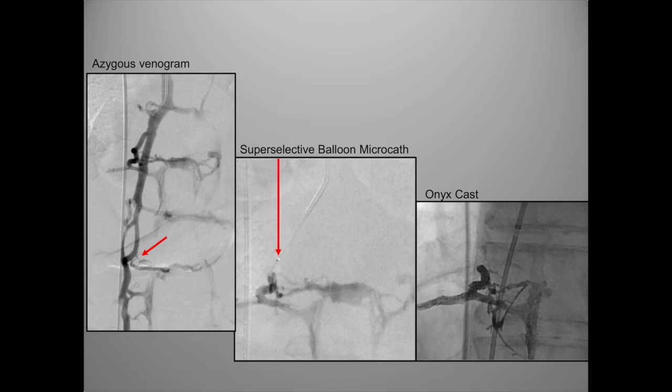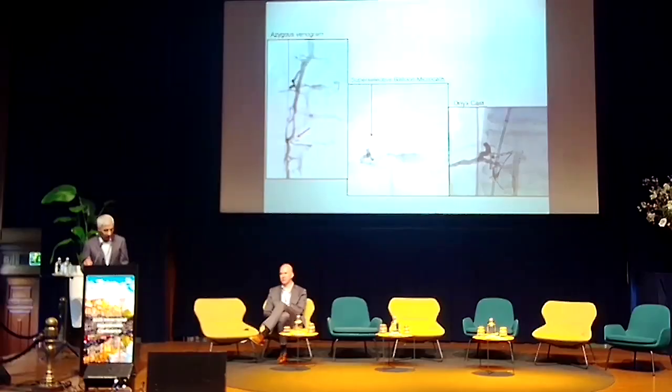And here you have an actual case where we drop the microcatheter and balloon to the level of the epidural neuroforaminal space, and then you see the glue cast exactly like the angiogram, that venogram that was done previously. And the more penetration you have into that neuroforaminal or epidural space, the more successful the procedure is. Although it's not 100%, we'll see examples of that. No matter how much you pack it in, some patients do come back.